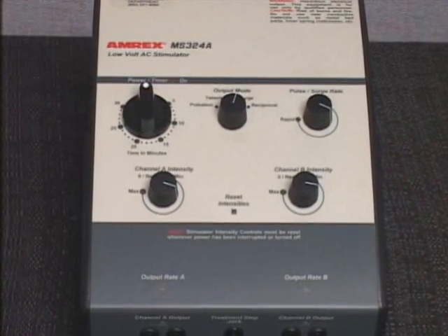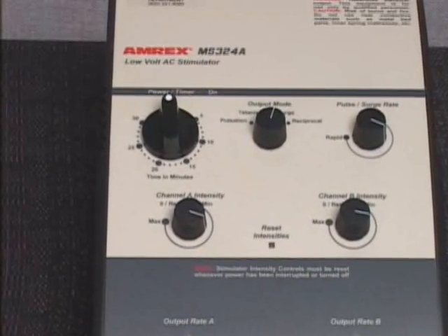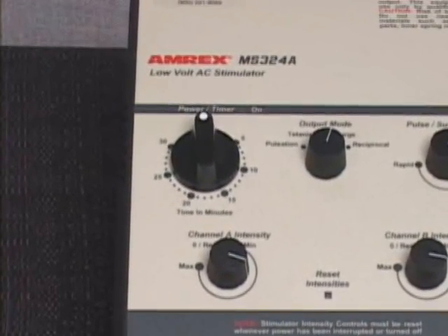The AC power will shut off and a bell will sound when the treatment duration is completed. To continue or extend the treatment duration, reset the power timer knob within 10 seconds of shutoff.